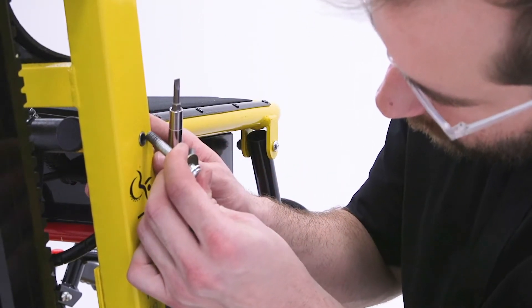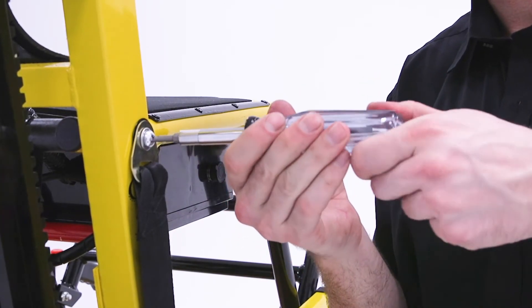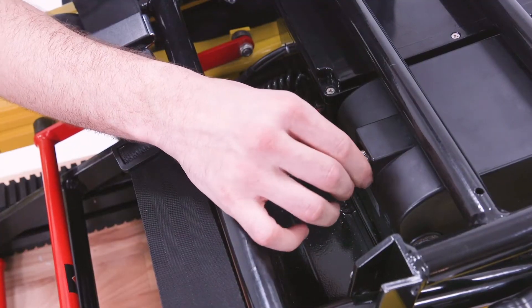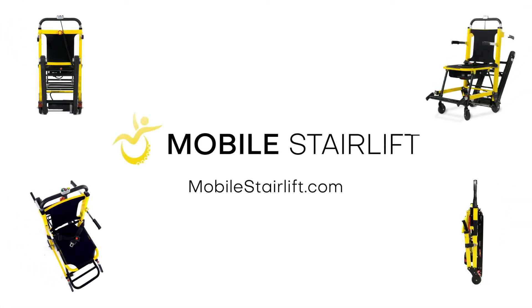Rotate the stairlift so that it is right side up. Thread the seat belt bolts through the seat belt fasteners and insert and tighten the bolts with a screwdriver. Once you have thoroughly re-tightened both bolts and the battery cord has been reconnected, the stairlift is ready for use. For more information, please visit mobilestairlift.com.